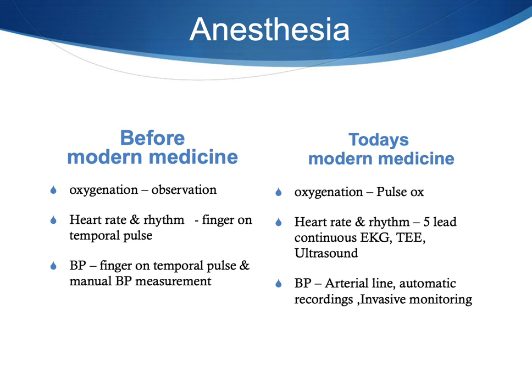Now this slide just shows the comparison of modern anesthesia tools to observe and assess a patient compared to old-fashioned ways. While the EKG and the pulse oximeter are instantly detecting any kind of changes in the circulatory system, acute changes in respiratory function, for example, anything with the upper airway obstruction, a laryngospasm, wheezing, endobronchial intubation, those things all can go undetected for a short but critical period of time when you're just relying on capnography, pulse oximetry, and the intermittent application of a standard stethoscope.